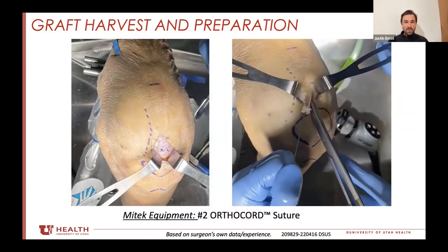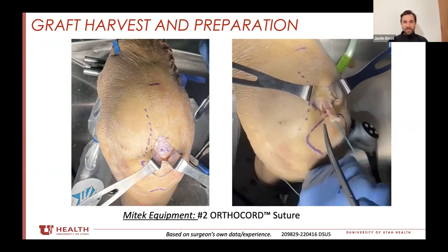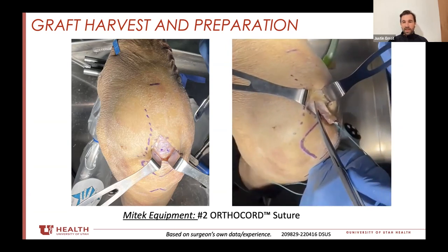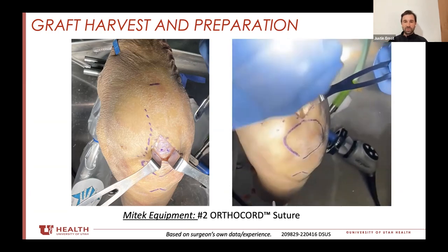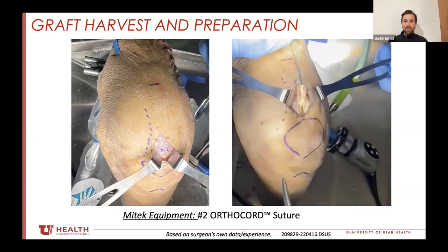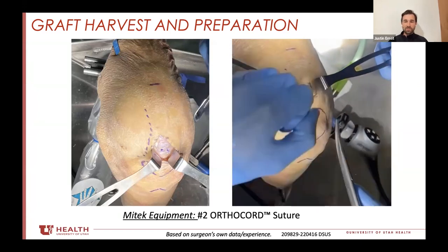Looking from the top down, I've made two marks nine millimeters apart right at the superior pole of the patella. I use a knife and elevate off a little nubbin of tendon. Once I have a nubbin free, I whip stitch just the end of it so I can get control of the tissue. After that it's kind of game over — I've got my width dialed in. I simply use a pair of Metzenbaum scissors and go up each medial and lateral side, as well as up the deep side, releasing it up through the wound.